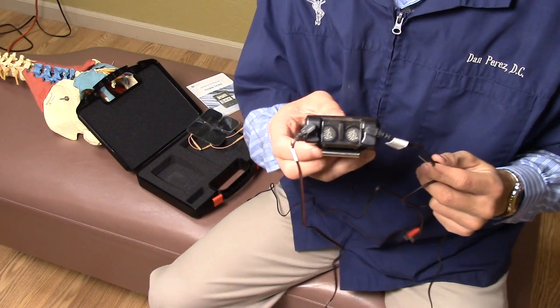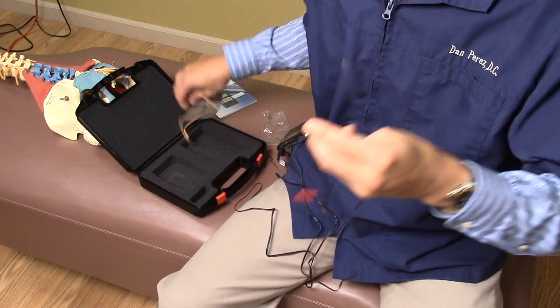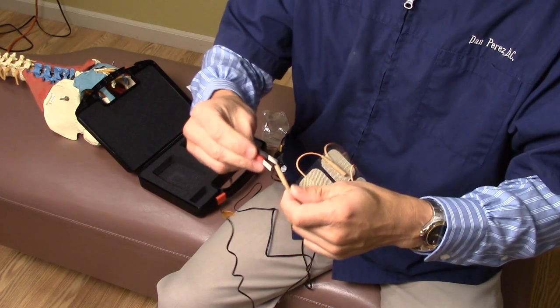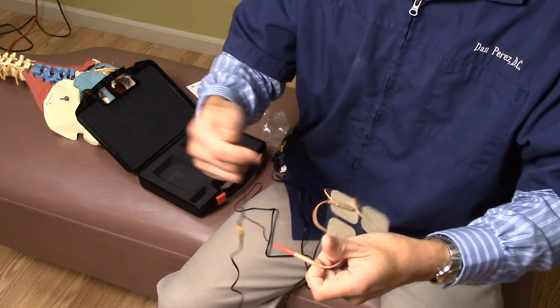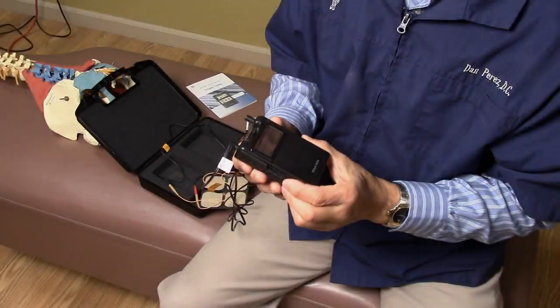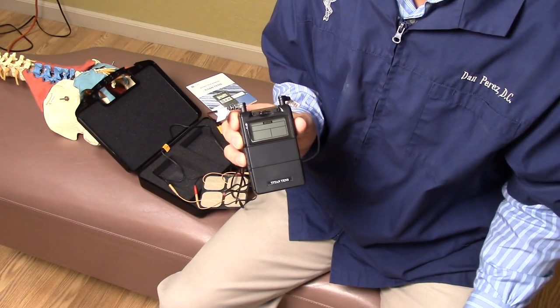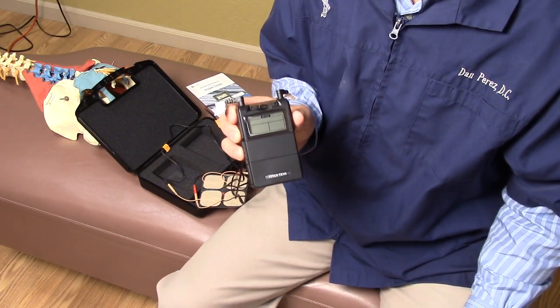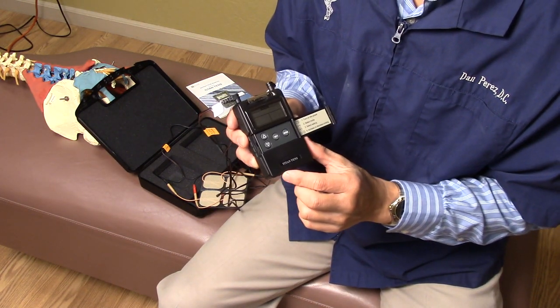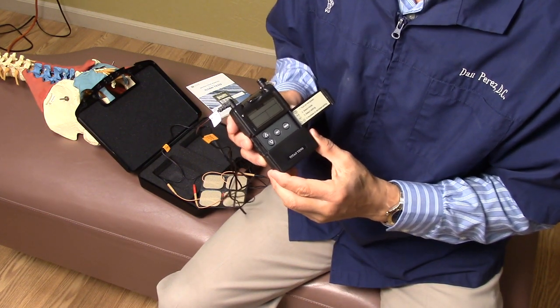I attach the leads — the left channel and the right channel — into the TENS unit, and to each one we attach one electrode. This is the LED display that will show you the amplitude and frequency of the electrical current. This area allows you to change the intensity, frequency, and amplitude of the electrical signal.